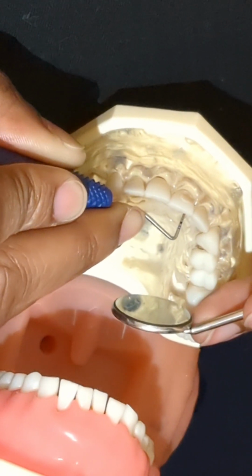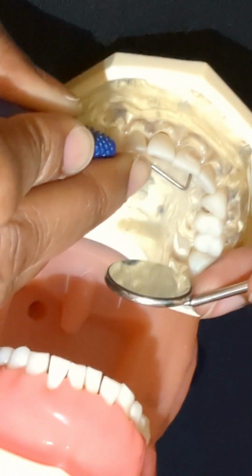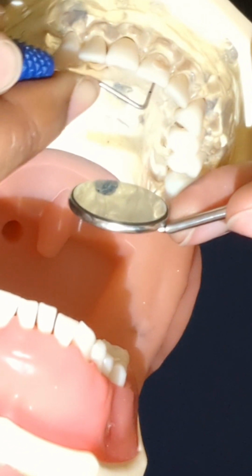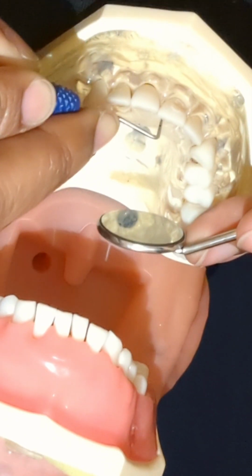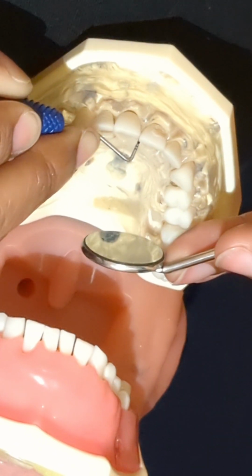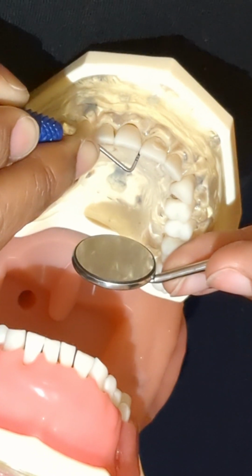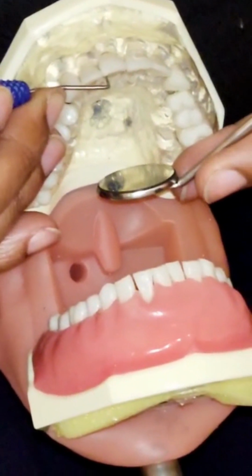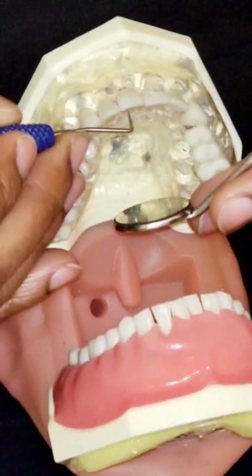Okay. We're going over to a 9. 7. And that is an 8. Distal line angle will be right here.